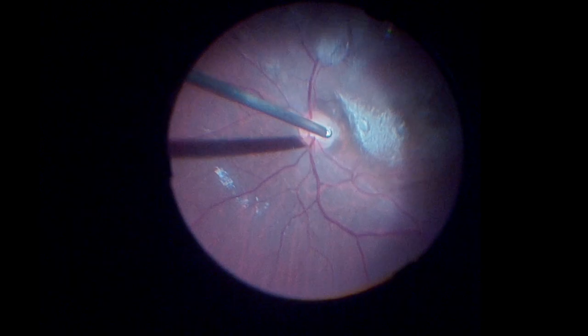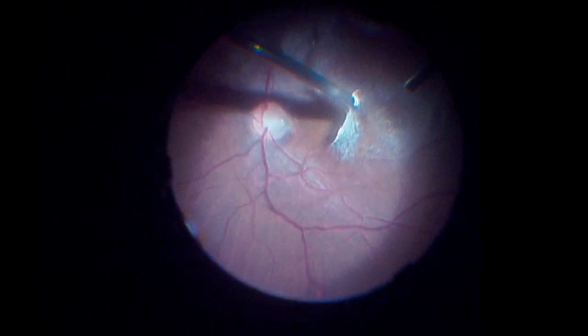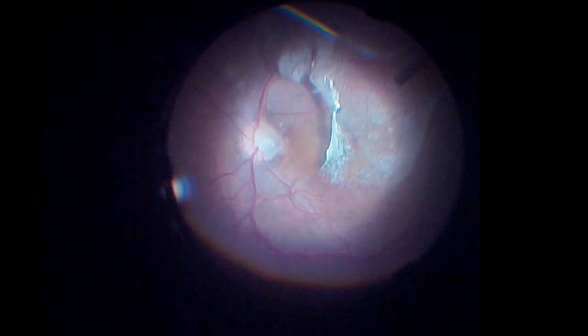Under subtenon block, 3 ports are secured, but a 25 gauge and 2 23 gauge were used, as the 23 gauge will help in easy transfer of the scleral graft into the vitreous cavity. After core vitrectomy, triamcinolone wash was done to stain residual vitreous, following which PVD induction was started.